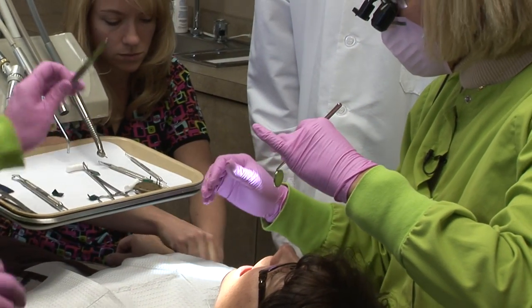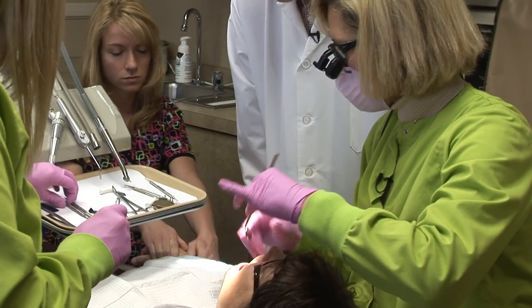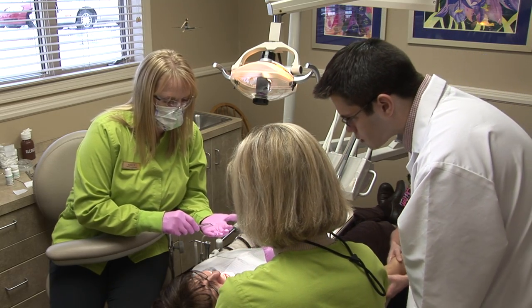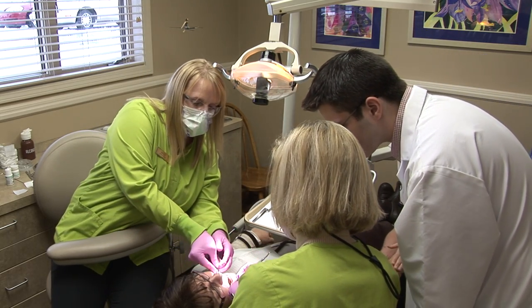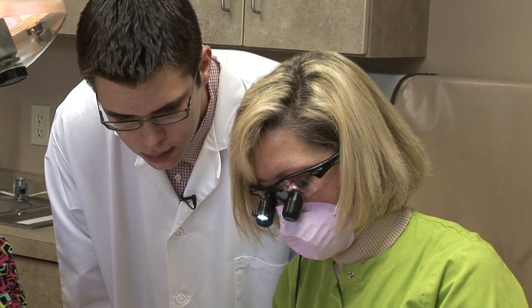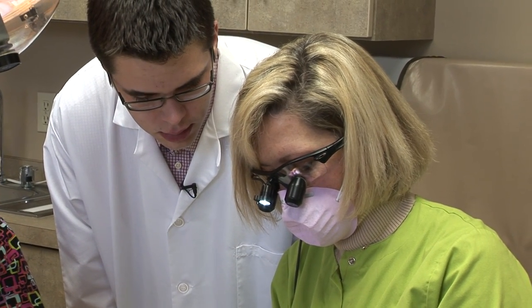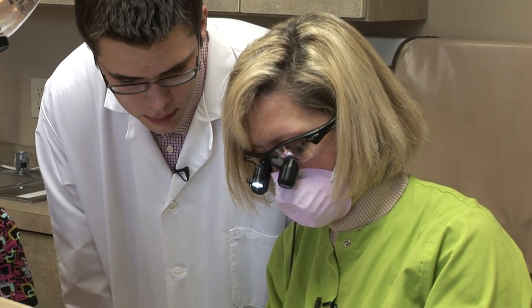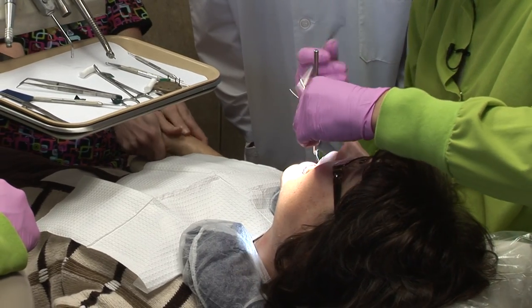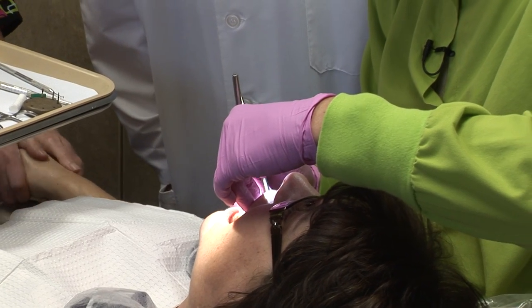Now we're going to press a little piece of string in between the tooth and the gum. There's a chemical on this called epinephrine, which is a naturally occurring chemical in the body — it's what creates your heart racing when you almost get in an accident. It constricts blood vessels, and is dipped in a hemostatic agent, which means that if there's any bleeding around the tooth, which there sometimes is, it coagulates it so that it stops bleeding. We get a nice dry field for the impression.